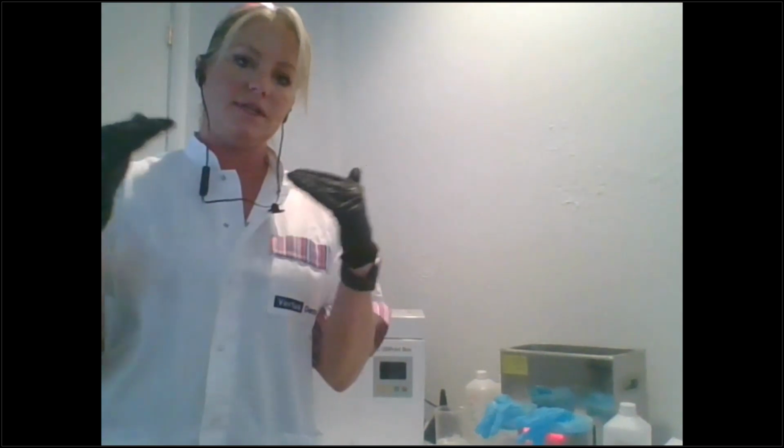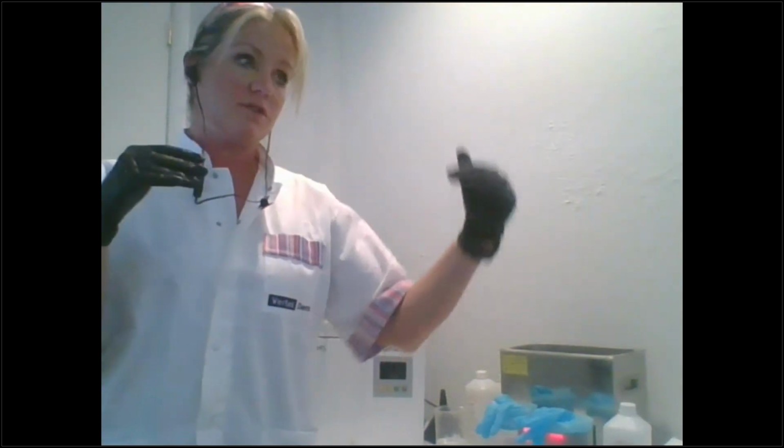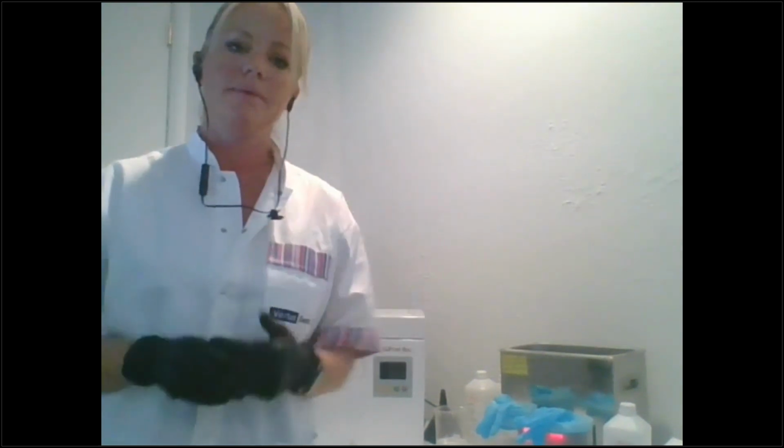So the longer the job, the worse the time difference would be. It doesn't have an automatic updater between the printer and 3D Sprint, so when you go to check on it, it won't measure up. But we have addressed that issue, so it should only be within a couple of minutes now. Make sure you're on the newest version of Sprint, and if not, then try to get upgraded because we did fix that. Okay, thank you.